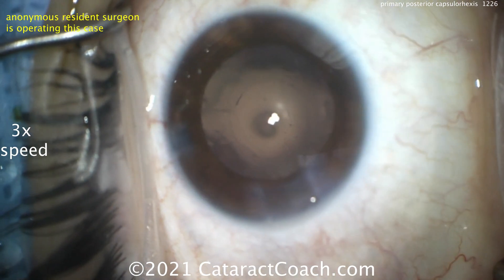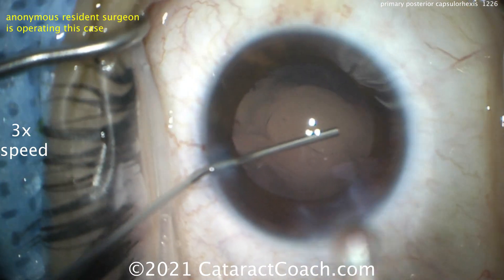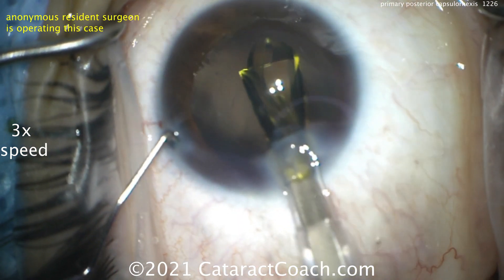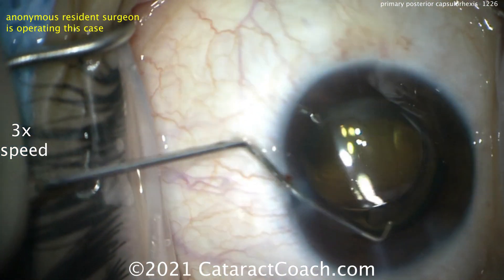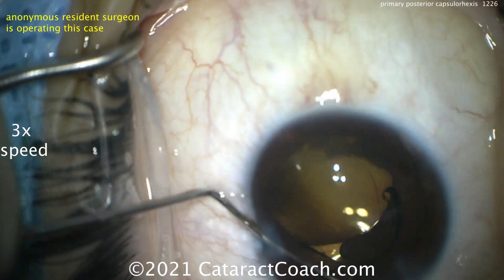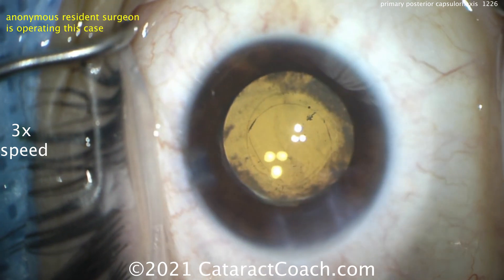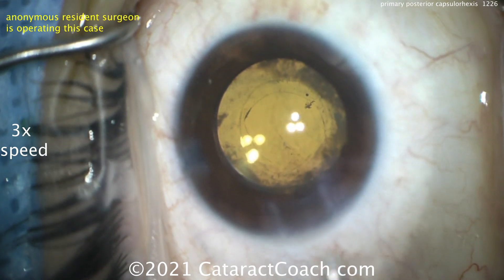Now, being very careful when we put the lens in. Don't aim the lens towards that central posterior capsulorexis — you want to get this lens dialed in just inside the capsular bag. Nice and even, barely sneaking it under the anterior capsular rim. Be very gentle, minimize manipulation, and get it into position. There it is. You can see the beautiful posterior capsulorexis and the anterior capsulorexis — very clean, very easy to see, and no vitreous prolapse at all.